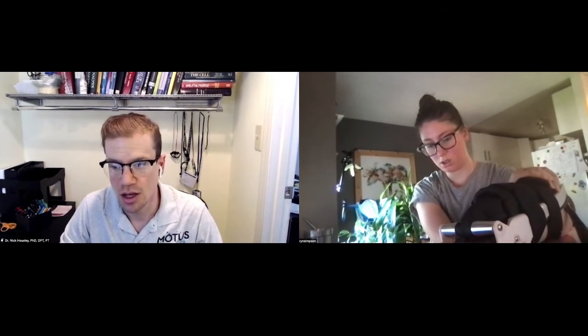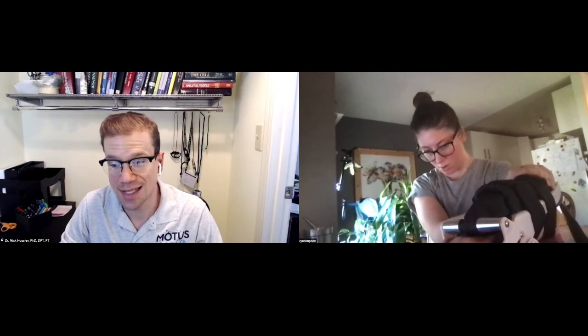So let's go ahead and do this really quickly. Let's have you, again, try to move down as far as you can. We're doing this again, just to check. Very good. So that time we're actually moving down, right? That's good. And so we'll stop there for a second.